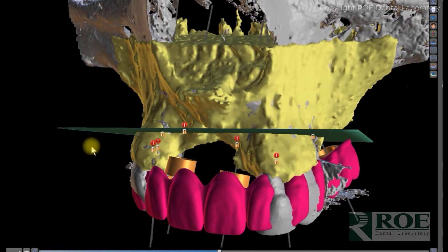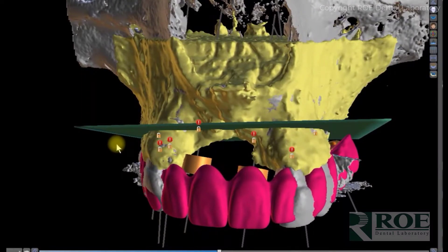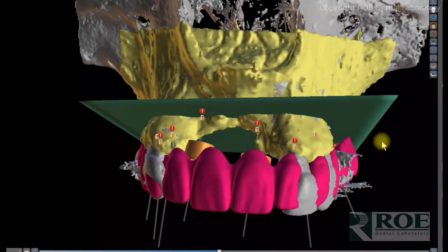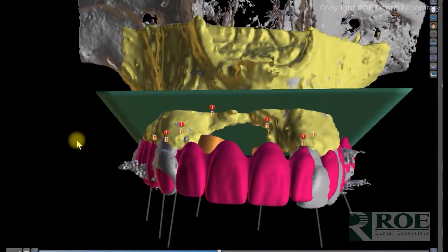You can see our bone reduction level — traditionally it may have been very high in order to flatten the ridge up to the defect, which is a lot of bone reduction. Instead, the doctor opted for FP1: we place implants in sockets where available, including implants up high, and deliver an FP1 prosthetic.